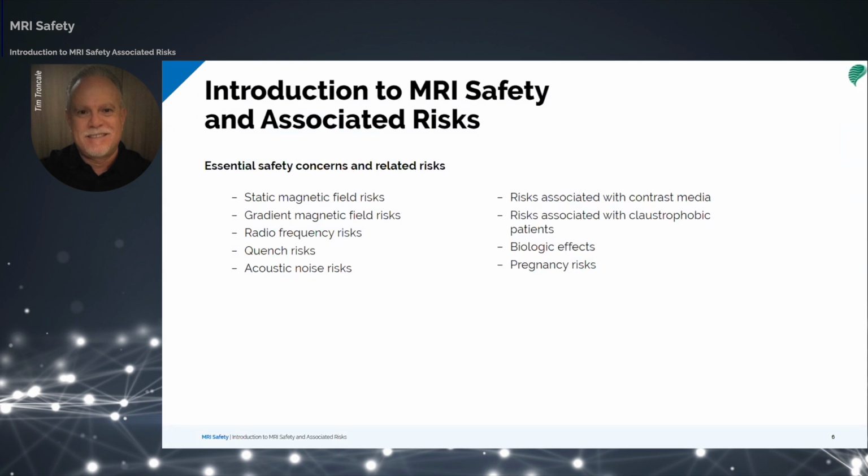Now that we have described our objectives, let's take a look at all the safety issues in MR and the risks associated with safety concerns. Please note that it is important to follow the policies of your institution and that the facility keeps their policies up to date. Refer to your MR safety officer, MRMD, the American College of Radiology, MR safety websites and materials, and/or manufacturers' recommendations. So we'll look at these safety concerns here on the screen.